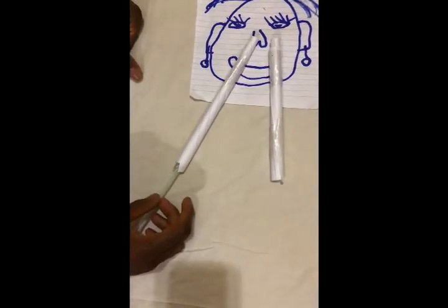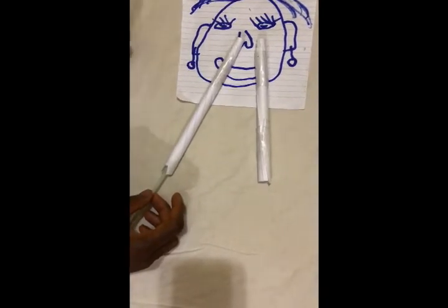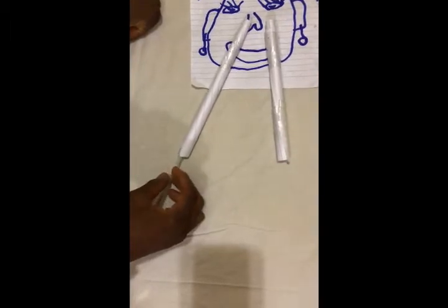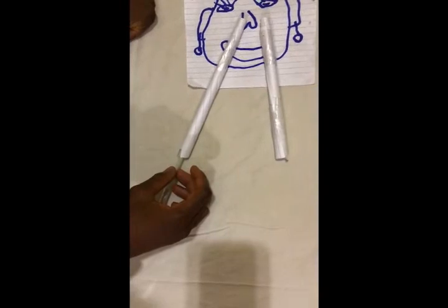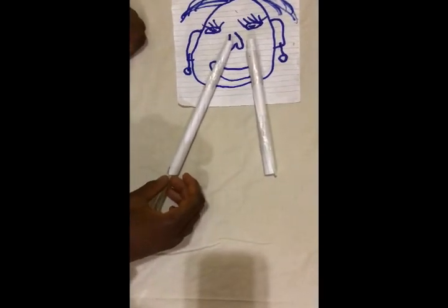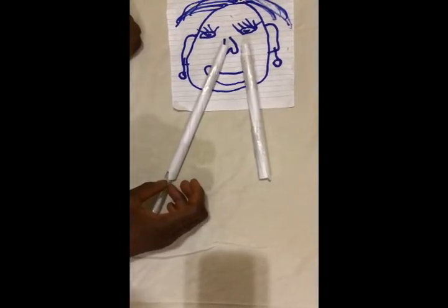And when it goes to a certain point, you have to rotate the tube 180 degrees so that you can resume alignment with the normal anatomical curvature of the nasopharynx and the nose. And you continue on into the oropharynx.